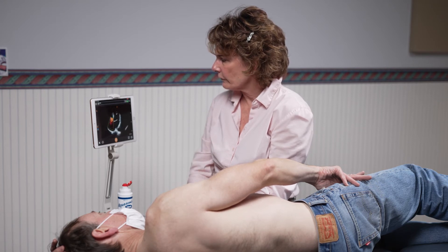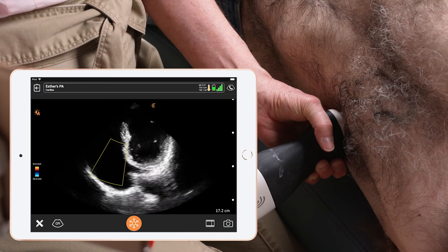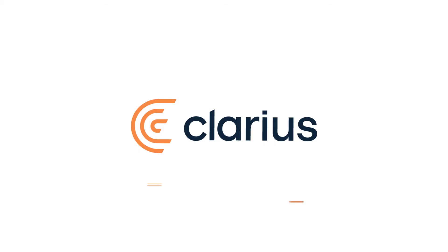I can evaluate for any regurgent jets. As you can see in this patient, I can clearly identify that regurgent jet in the tricuspid valve.